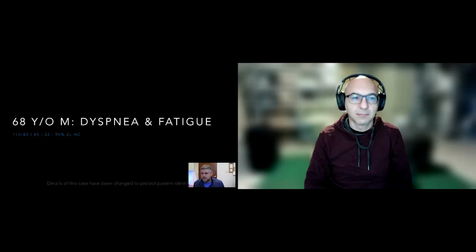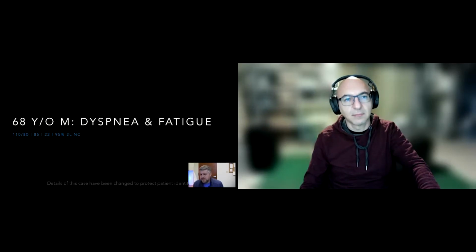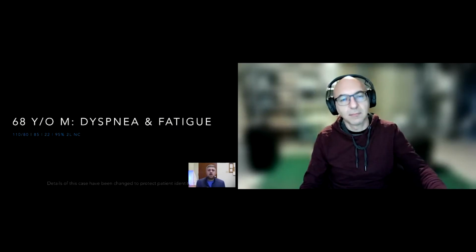Heart rate's fine, a little tachypneic, 22, satting 95% on a 2-liter nasal cannula oxygen requirement. We can just say that maybe that's new. Maybe it was in the low 90s when they first rolled in, and now they have a 2-liter oxygen requirement. So you get this picture. This is something that we see routinely in the emergency department, certainly not an uncommon presentation, even from the ED up to the critical care environment. We can start picturing in our heads patients that we've seen like this.